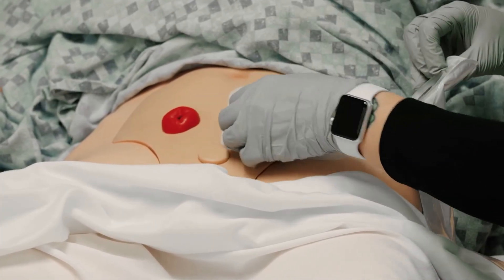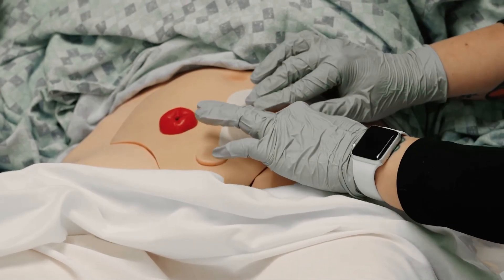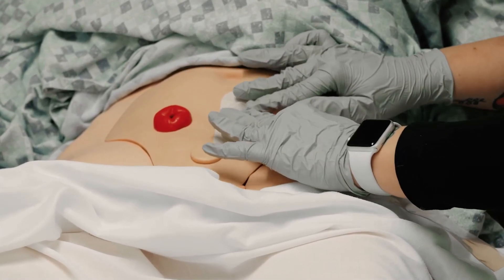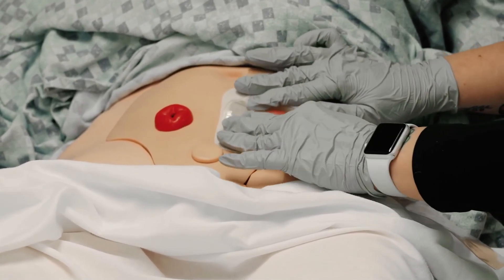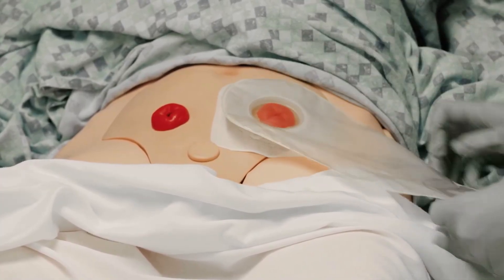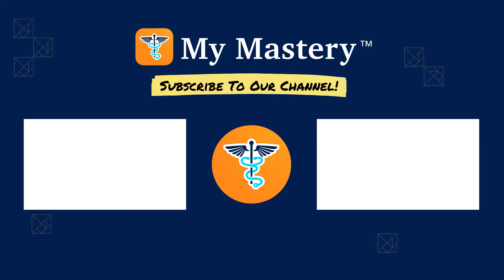Some systems allow you to pull up here so you're not pushing down on your patient. If you're certain about your size, you could attach the bag ahead of time — it just snaps on real easy. Then just make sure that the bottom end is secured. And that wraps it up for ostomy care.